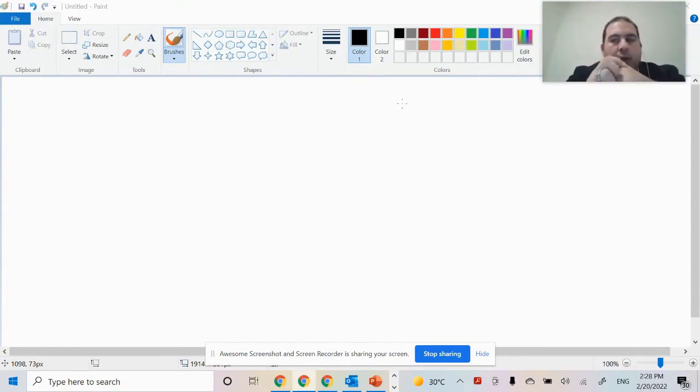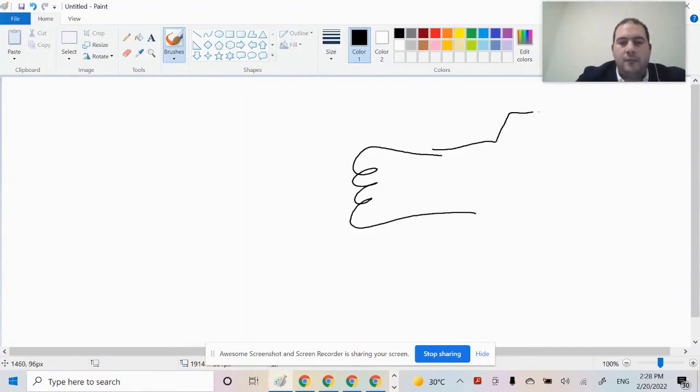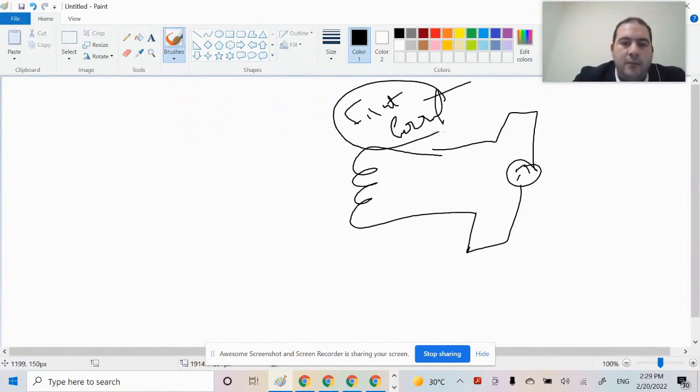The cathode, as I mentioned, is connected to a specific electrical circuit. This electrical circuit carries an electric current, meaning it has a current flowing through it. When we talk about the filament or cathode, it is also carrying an electric current, which means electrons are moving and circulating inside the wire or filament. So this movement of electrons creates a current, which I call filament current.